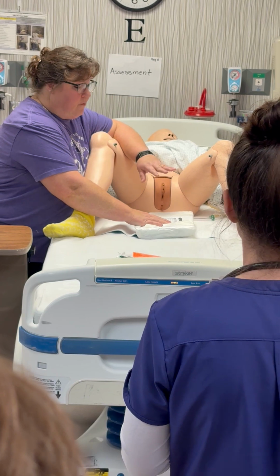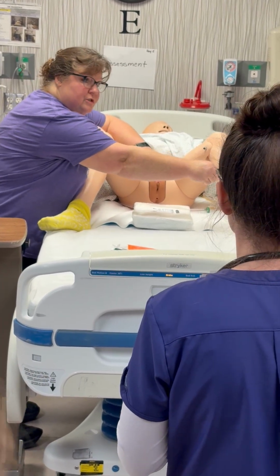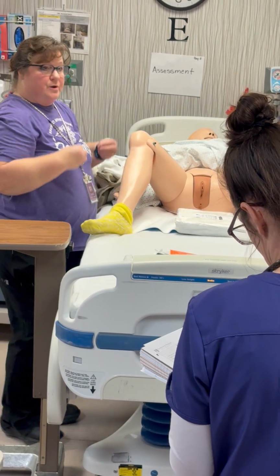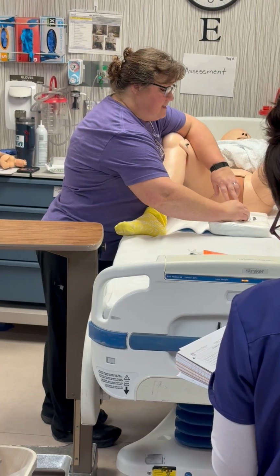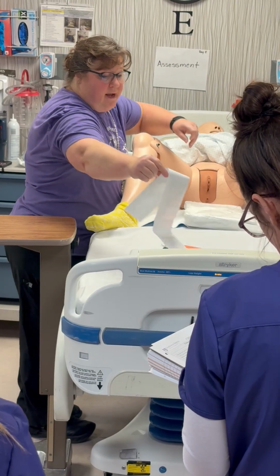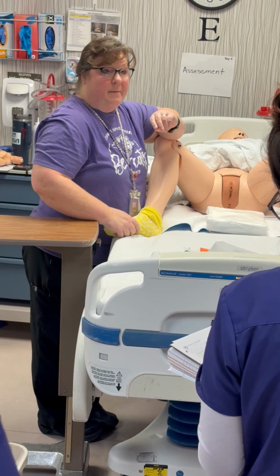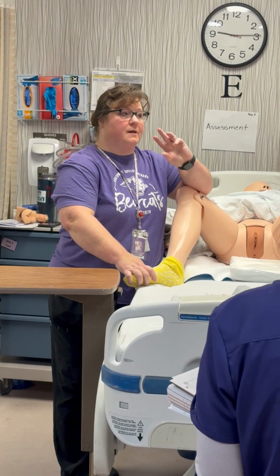So remember that when you open up a sterile tray, you open up away from you first, okay? And then you open to the sides and then toward you last, okay? So for this, I'm going to open away from me and take this out, and it's trash. Okay, now I'm starting to get to the sterile part, remember? So this is the hard part because you have to remember what's sterile and what's non-sterile.